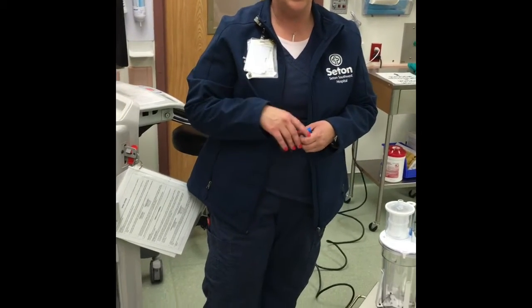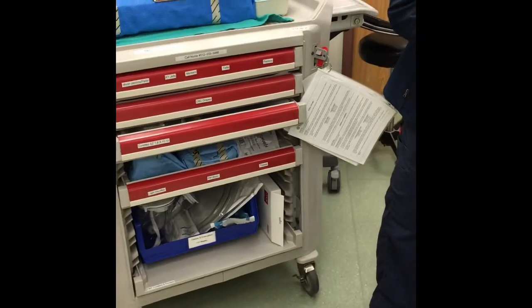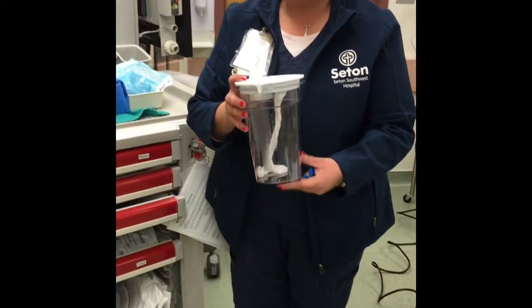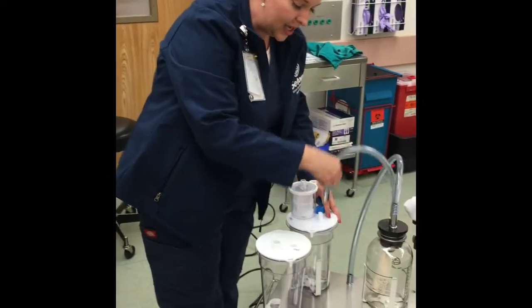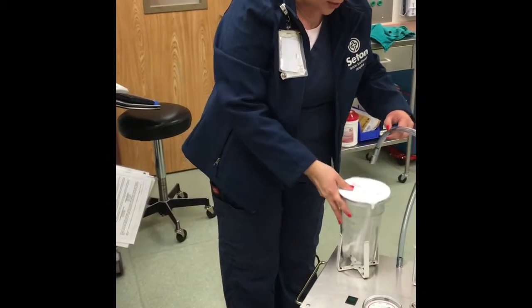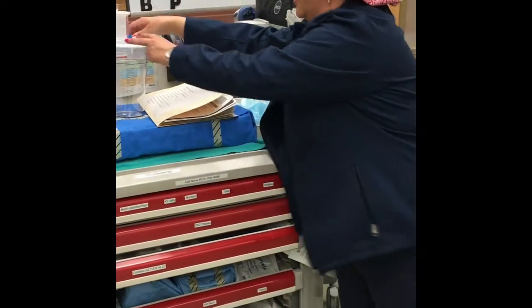If this was a bigger loss, then usually over 10 weeks, sometimes the doctor will tell you that they need to do a D&E. In that situation, you would switch to a different canister due to the size of the products of conception, and that would just do the same exact thing. You would remove it the same and put it in the same, and it would again connect up here. You would have this go here.